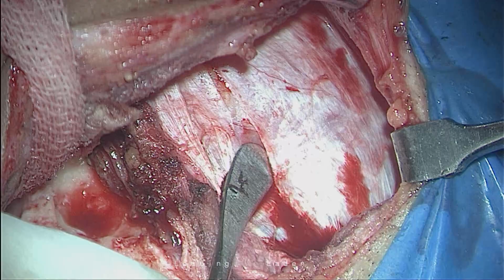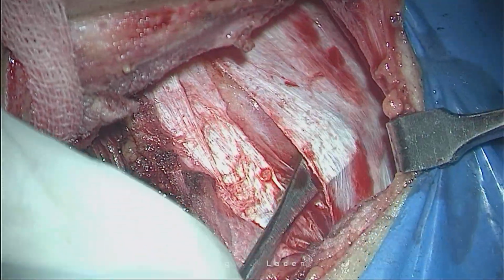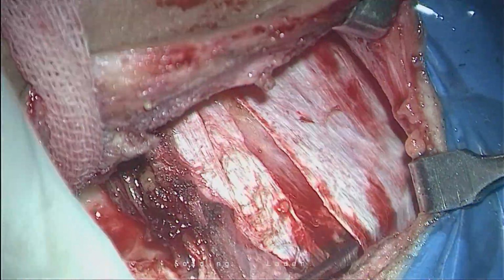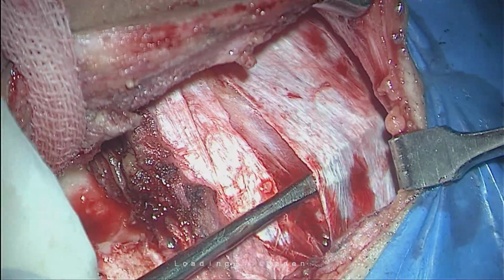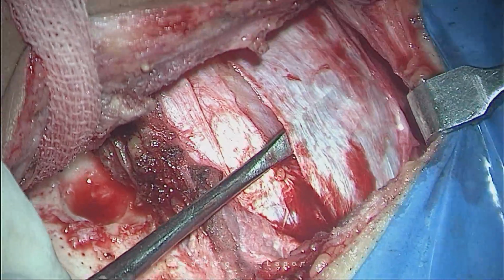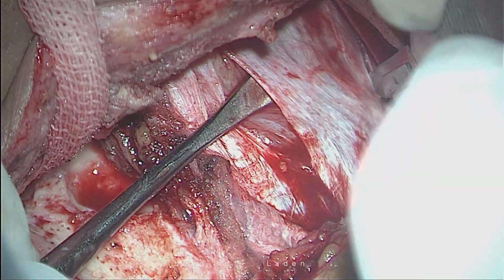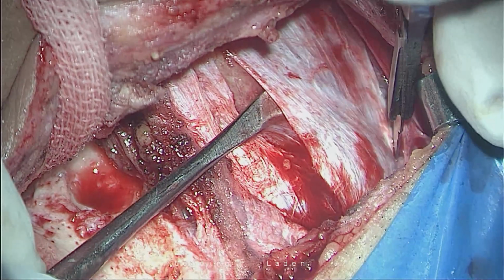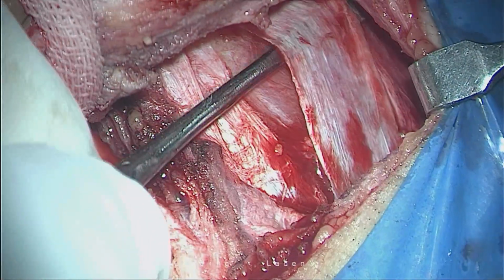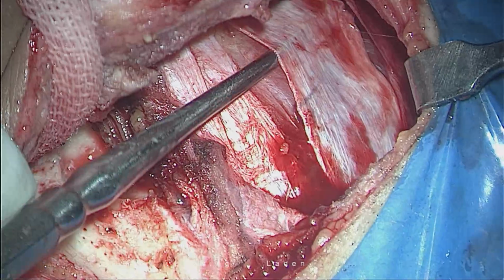See this? The dimension of the graft, according to experience, you can measure on the table, rather than doing any XYZ thing afterwards. So this is the size of the graft which I am going to use in this particular scenario. See this? The true fascia graft. Can you see? See the underlying muscle pretty intact.